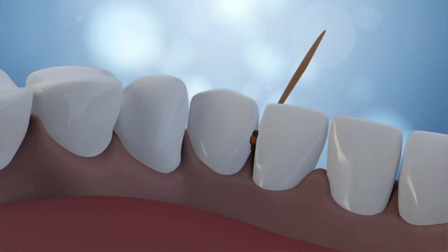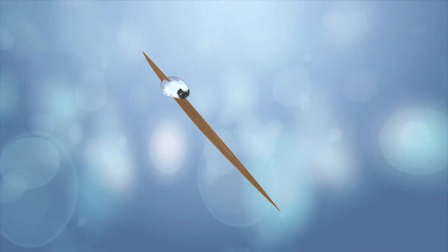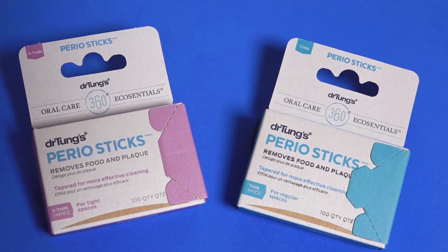Periostics slide into crevices where food particles collect. When moistened in the mouth they bend for hard to reach spaces. Choose from thin and extra thin to fit your mouth perfectly.